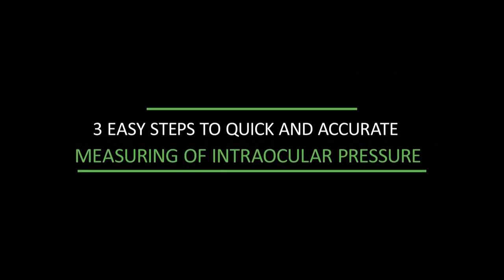It takes three easy steps to measure intraocular pressure quickly and accurately. Getting ready for use.